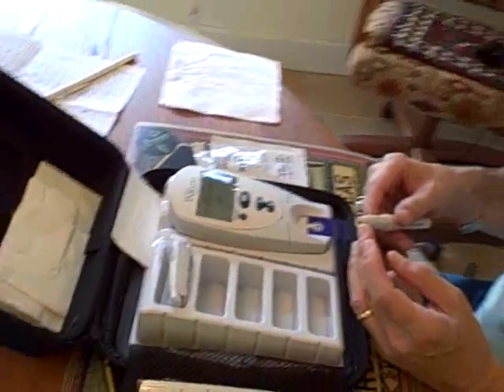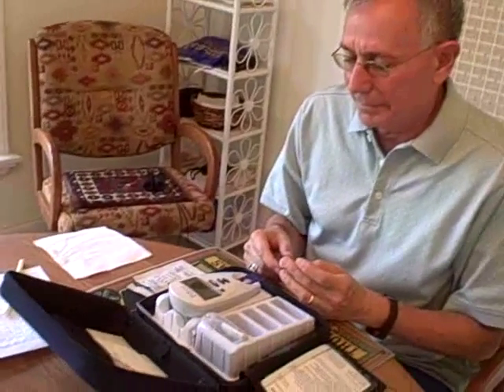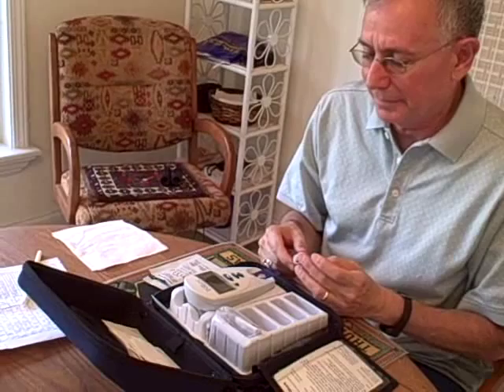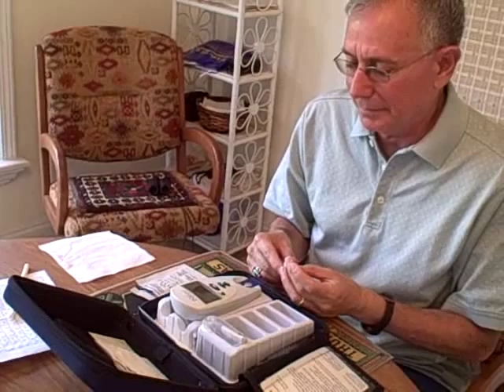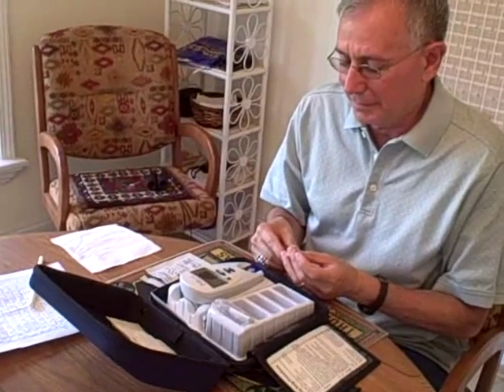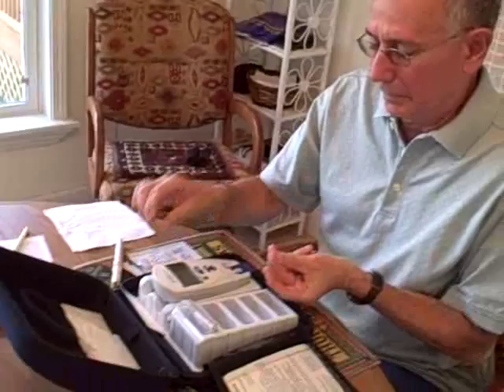He has been on Coumadin for 17 years, and before he got this monitor to self-test, he had to go to labs. This was a very annoying monthly process and was very inhibiting when we were traveling. Now that he has this very small portable monitor, he can do it himself.